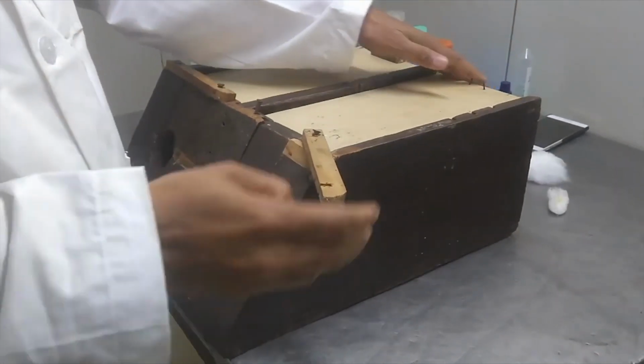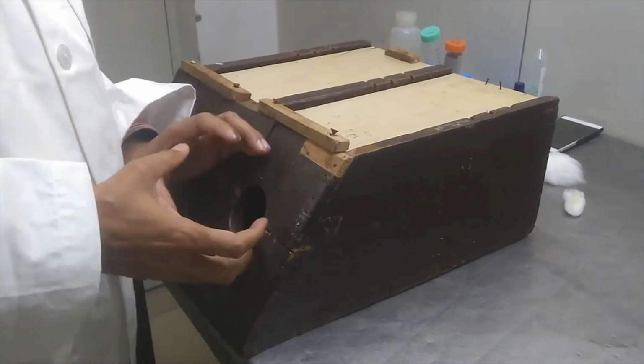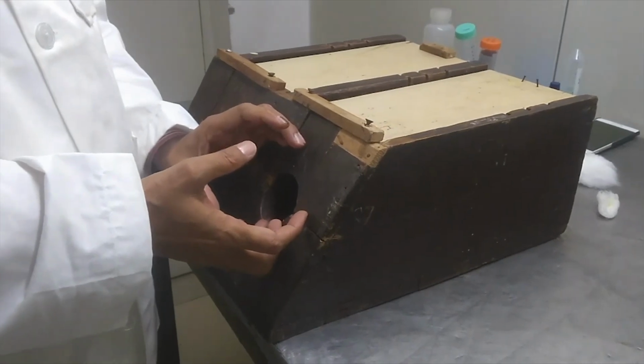Like this. And we lock the neck region, and the animal is ready with his head out and the ear outside, from where we have to bleed.